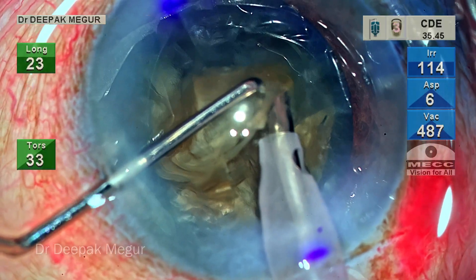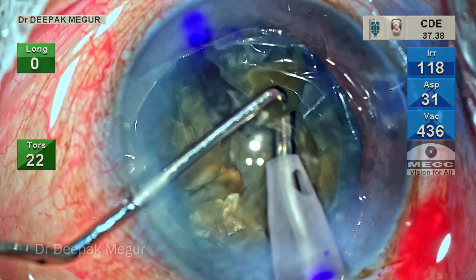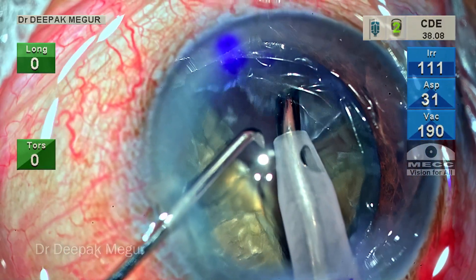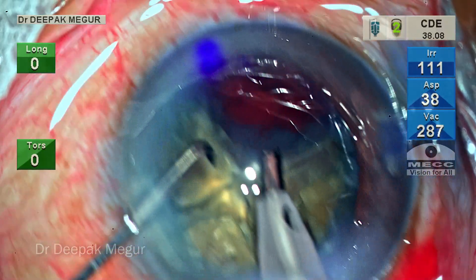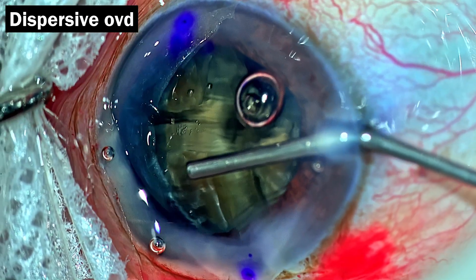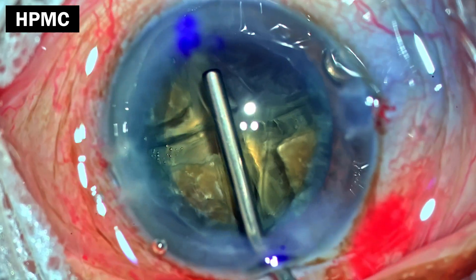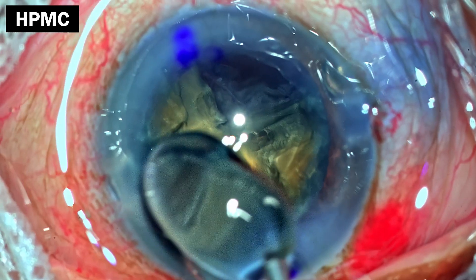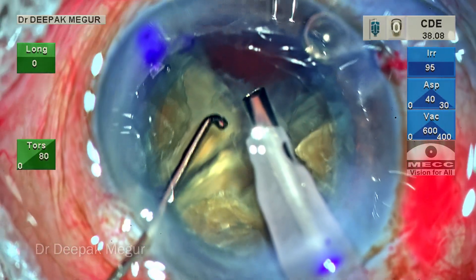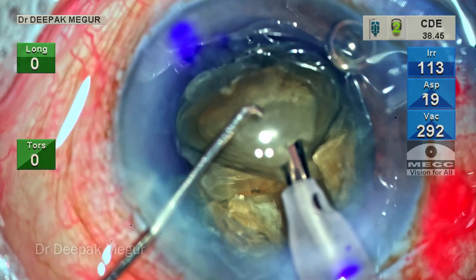One of the fragments is pulled out of the bag and emulsified. The epinucleus remaining is also pulled out and emulsified. At this point, I come out and put in some OVD again to ensure that the endothelium does not bear the brunt of nucleus management. The dispersive OVD goes in first, followed by HPMC underneath it. It's just a few more minutes and it's definitely worthwhile to slow down, push in OVD, and safeguard the endothelium.